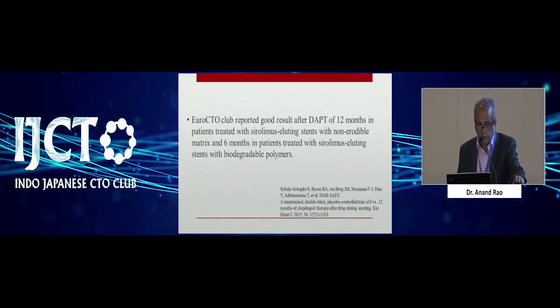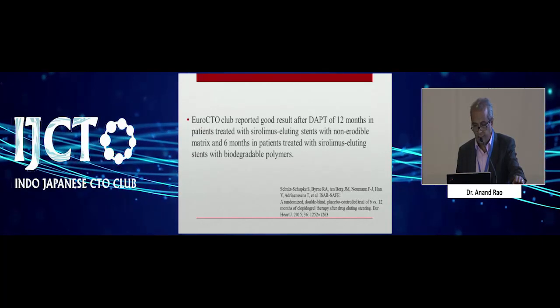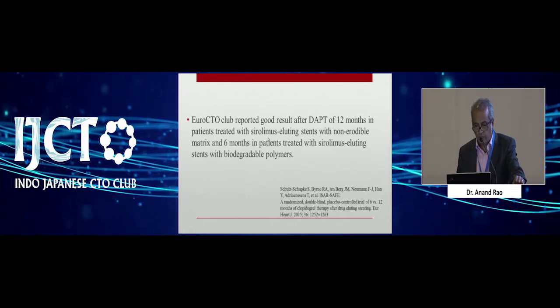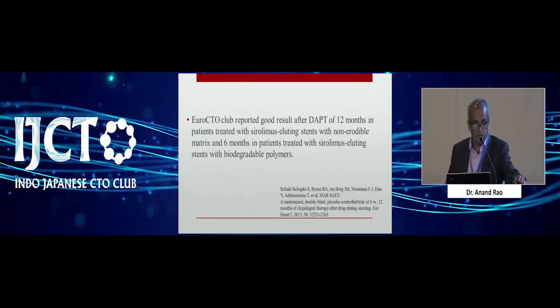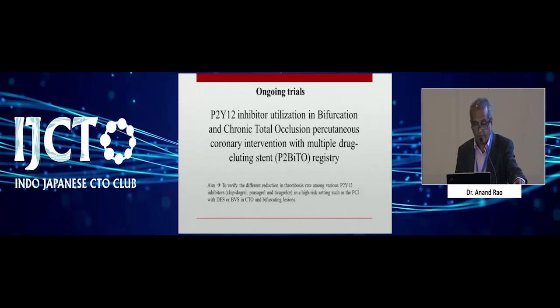If you look at the Euro CTO recommendations also, they said that DAPT treatment for 12 months was good enough in sirolimus eluting stent with non-erodible matrix, and 6 months in patients with biodegradable polymers. So more or less, it's a standard thing what they have recommended.